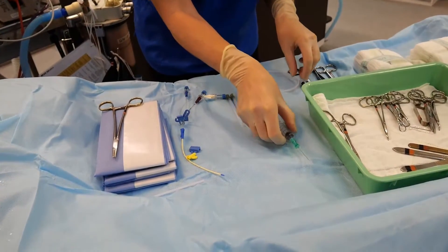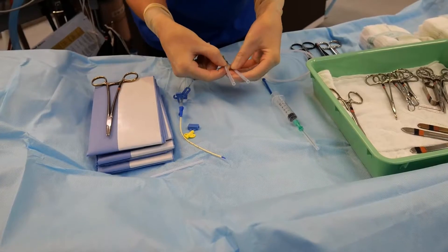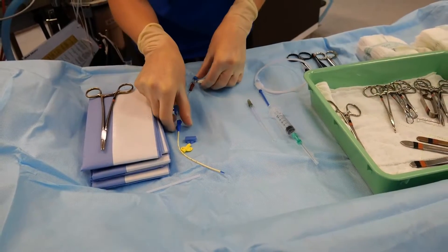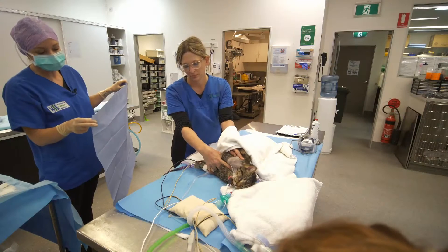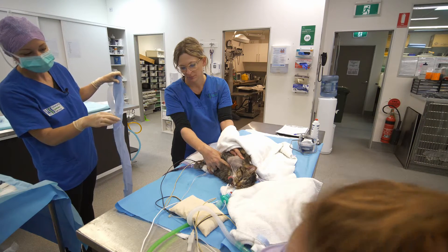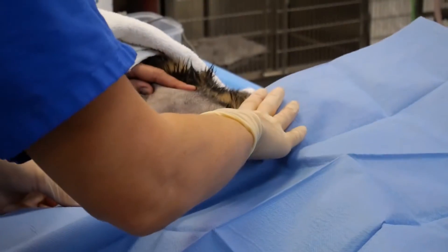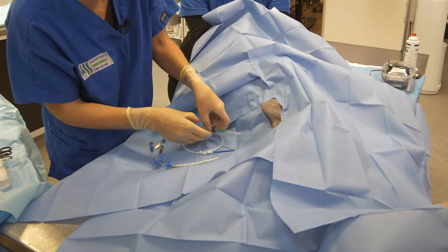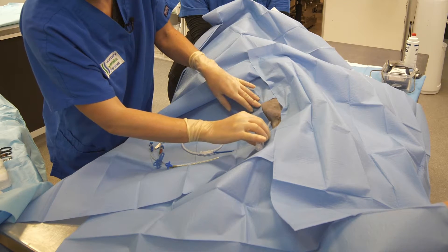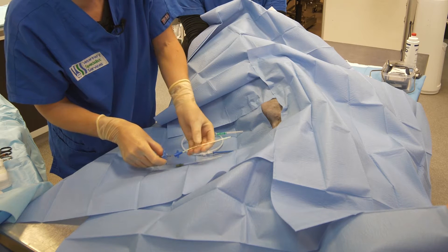Basically, we're going to draw blood out through the catheter, then the guide wire is going to be placed through the catheter. Then we're going to dilate the jugular vein and then place the catheter — that should all become clear in just a moment. At this stage we get our assistant to hold up the jugular vein without touching the sterile field, and then we place our drapes once we're happy with the position of the vein. So this is our catheter that we're going to insert into the jugular, this is our guide wire, this is the dilator, and this is the catheter.